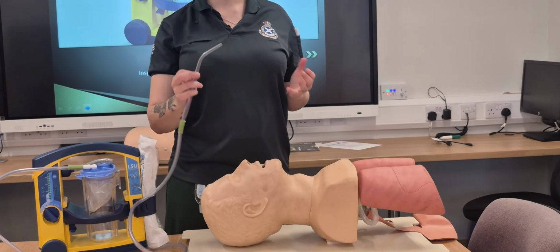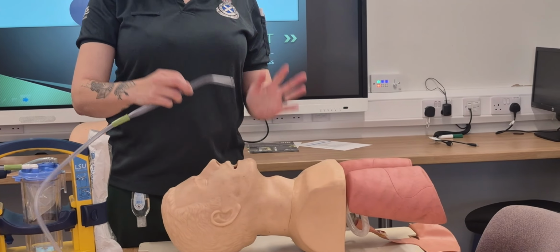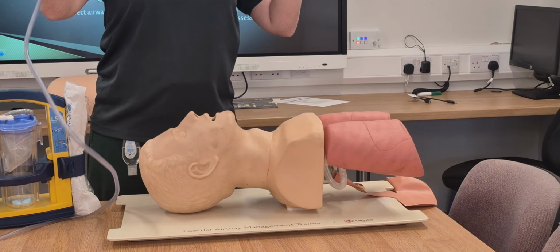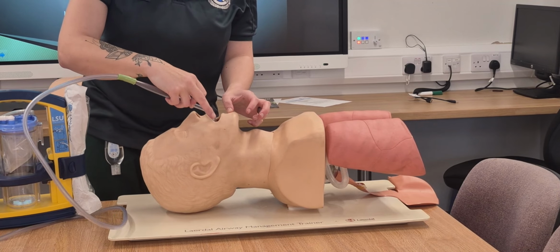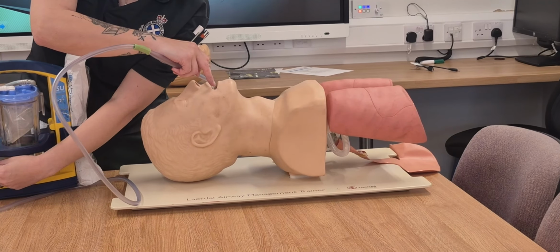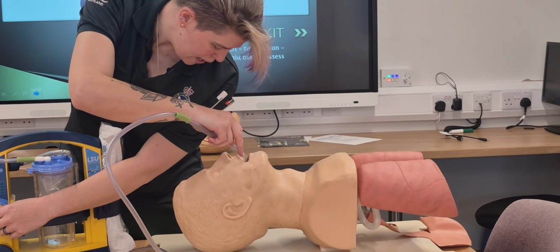A lot of people ask, do you turn it on first and then suction on the way down, or do you insert it and then suction? I'm going to suggest that you insert it first, because if you turn it on first, you're going to start suctioning the cheek and the tongue as you go down. So we're going to insert. I'm going to set it first. I'm also not going to take my eye off the end of it, because I don't want to insert it too far. We'll keep an eye on that.